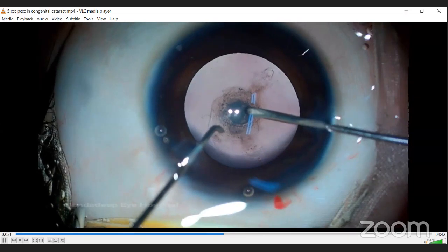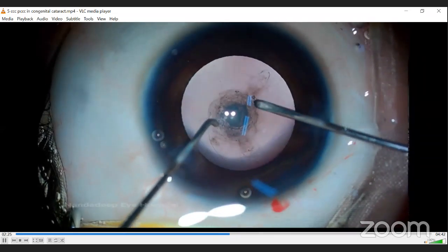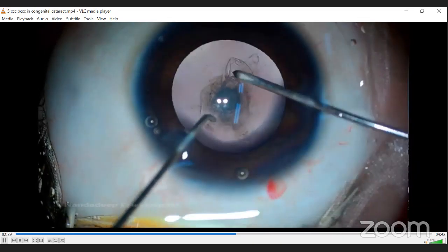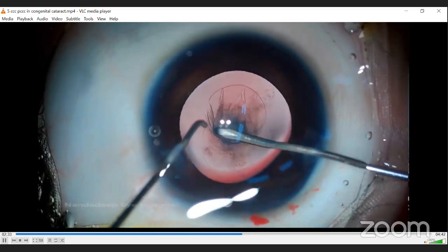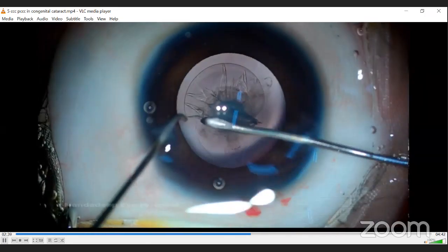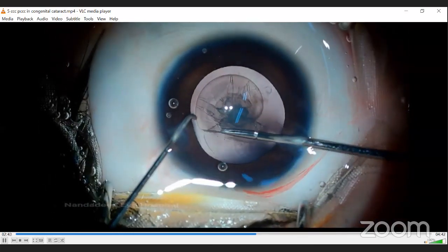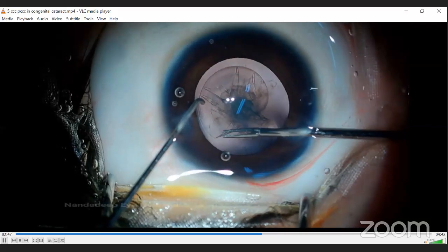Again, just another case. So using 1.8% sodium hyaluronate here, and now starting the rhexis. You can also proceed with a cystitome if you feel confident using it. But as it involves more of shearing force, as I said, whenever you use shearing force, it tends to become larger.